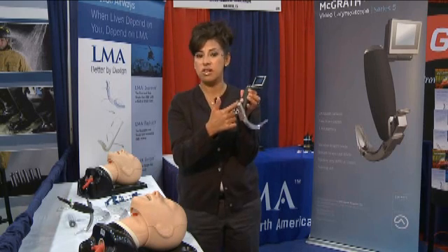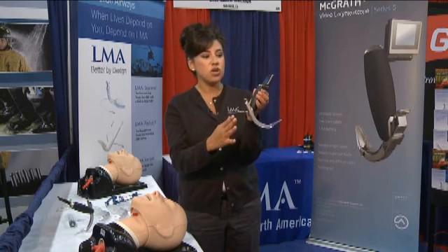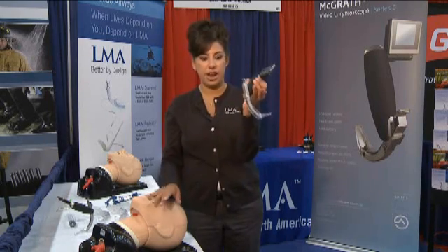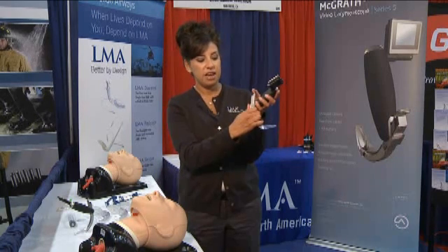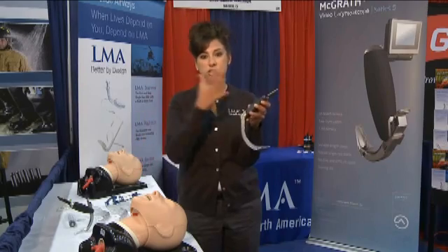The screen is attached to the handle, so you're able to intubate your patient in your direct line of sight. You only need one person to use this system. Everything is right here in the handle. It comes in three different sizes — small, medium, and large — so it fits patients from pediatric to adult.